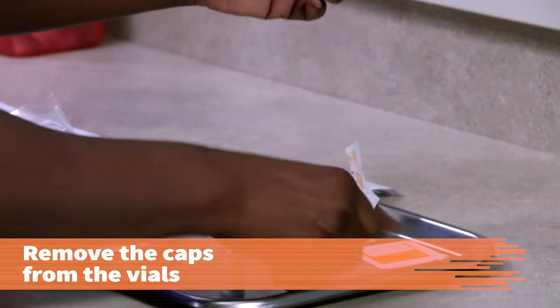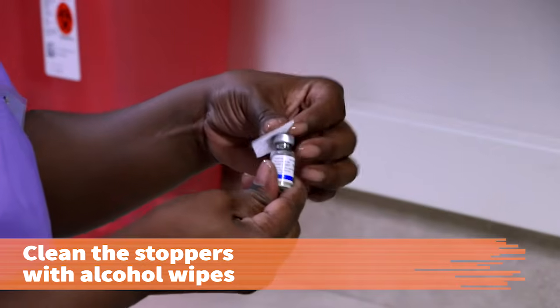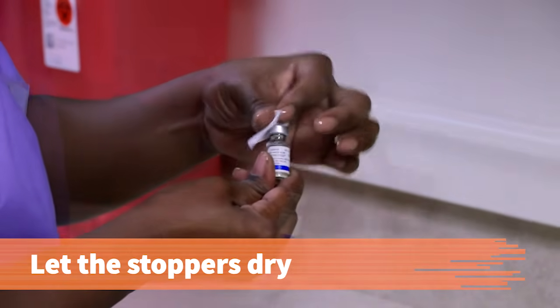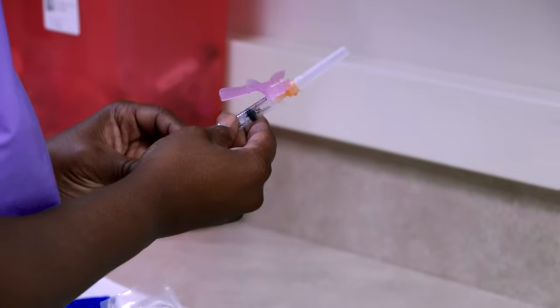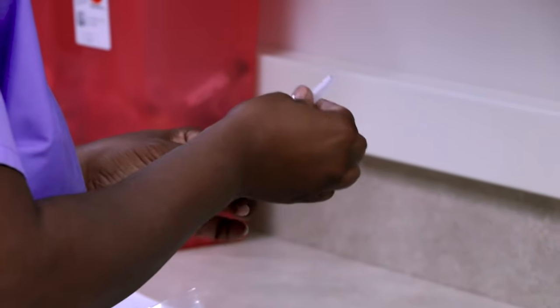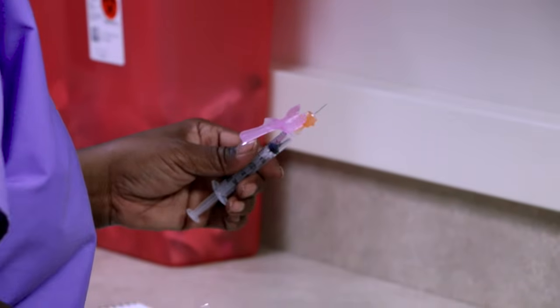Remove the caps from the vials. Clean the rubber stoppers of both vials with alcohol wipes. Let the stoppers dry. To keep the pressure of the vial equal, you need to remove the same volume of air as the amount of diluent you'll be mixing with the medication.